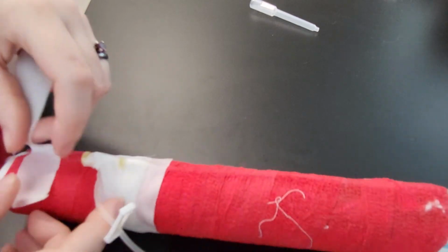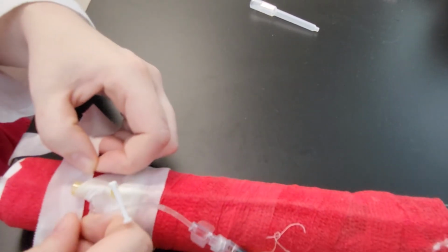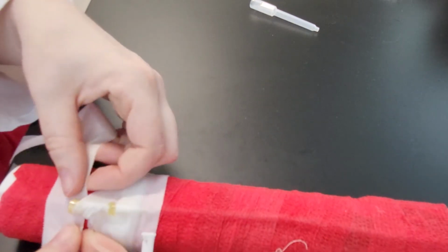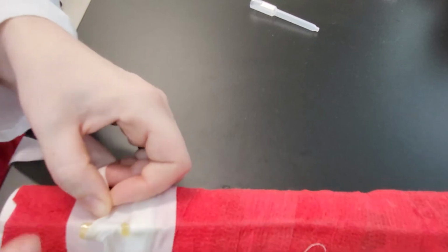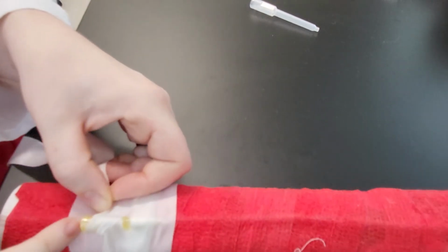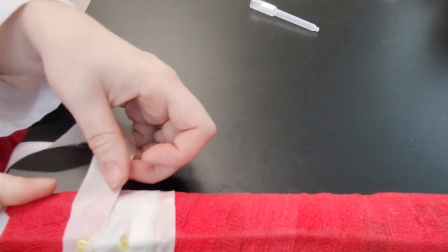So this piece of tape may be new for some of you, that you may not do this in practice, and that's okay. But here I would like you to perform this with this extra piece of tape. We place it sticky side down, and we place it so that it is basically covering anywhere where the injection port on the T-port itself is actually sitting on the arm. We do this for aseptic technique.